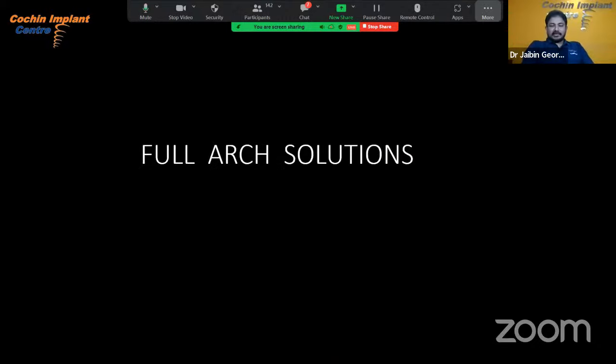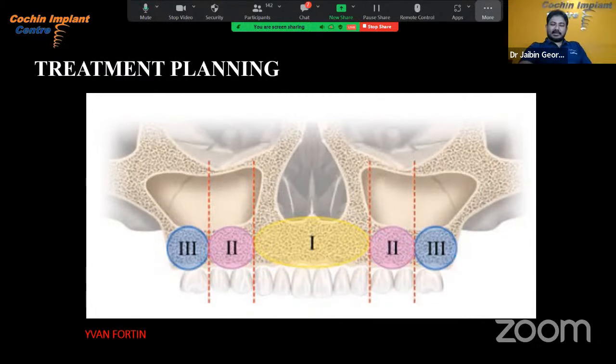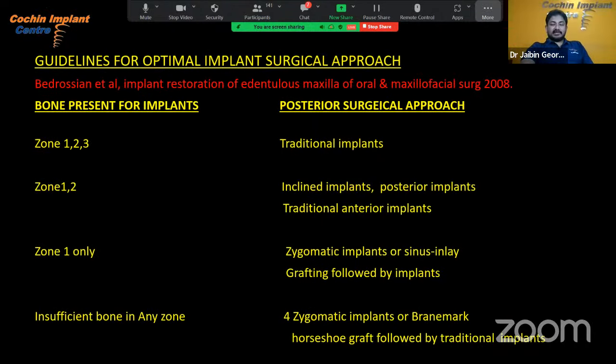Now I want to share with you full arch cases. Full arch in the maxilla is usually divided into 3 zones. If we have bone in all the 3 zones, we can place conventional straight implants. If we have deficient bone in zone 3, we can plan for all on 4 implants. If there is bone only in zone 1, we can plan for zygomatic implants. If there is no bone in all the 3 zones, the treatment plan is quad zygoma and pterygoids.